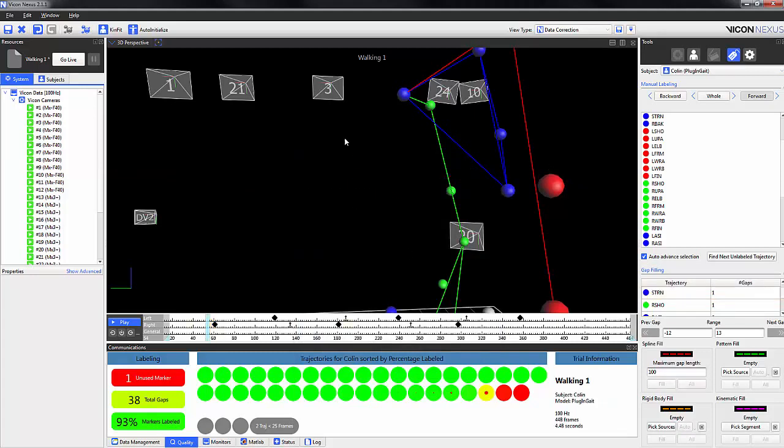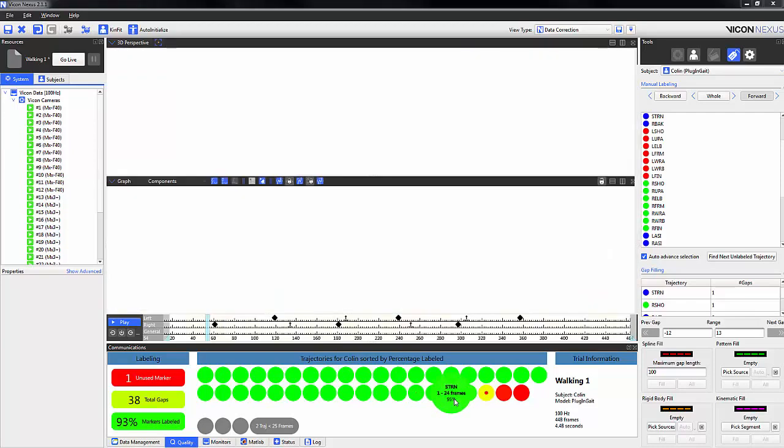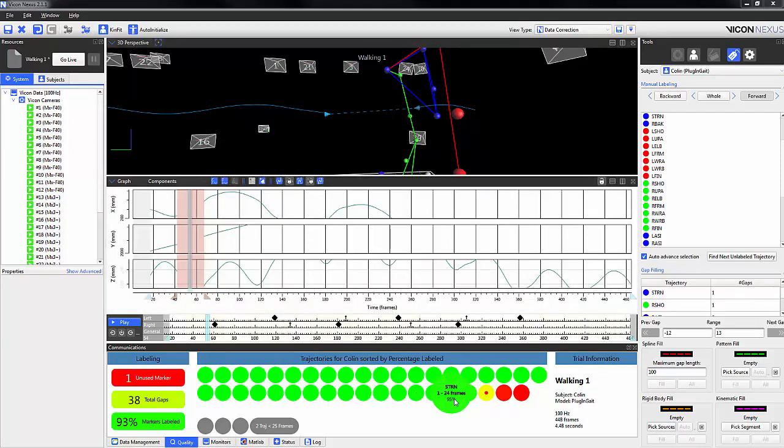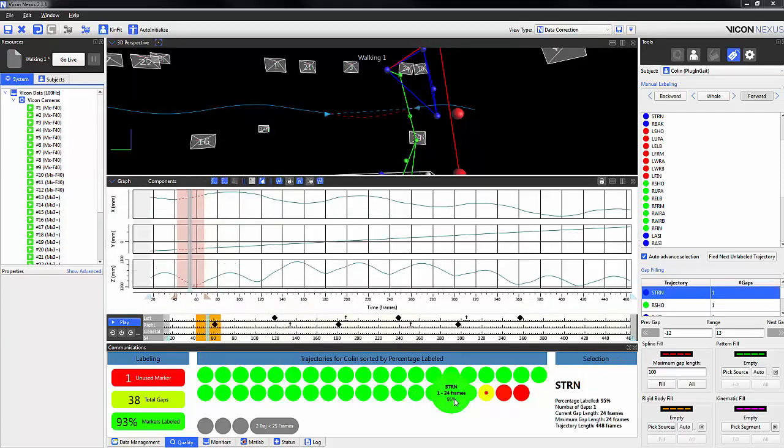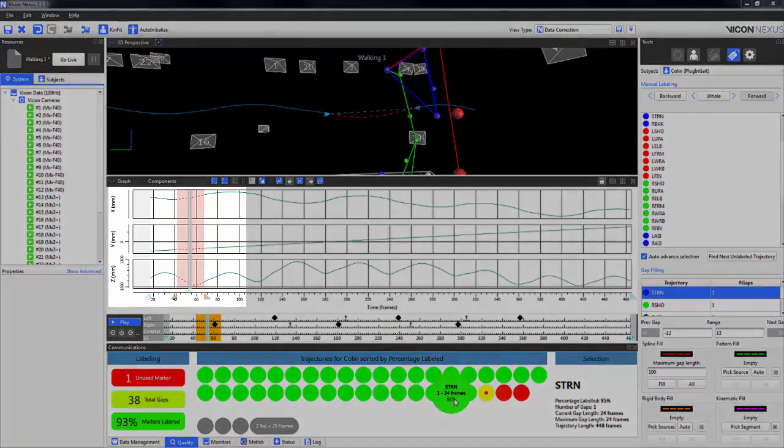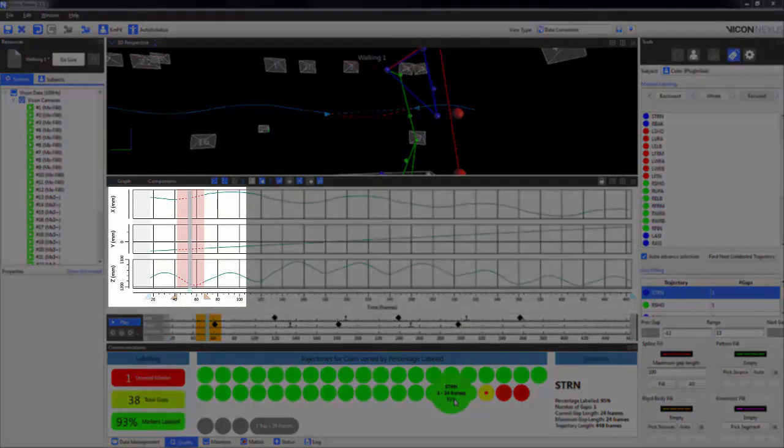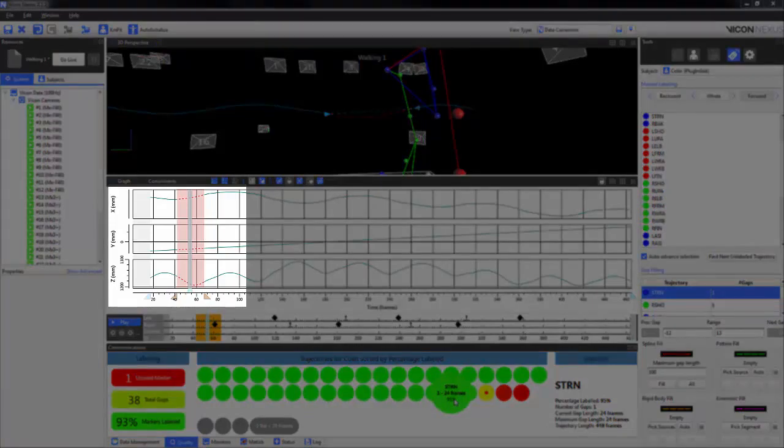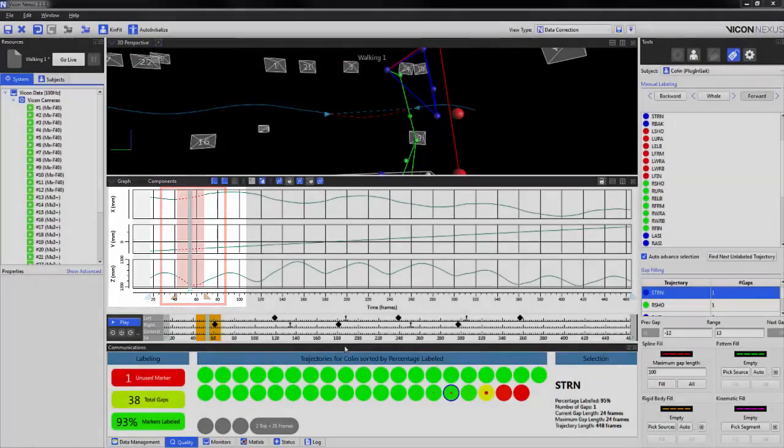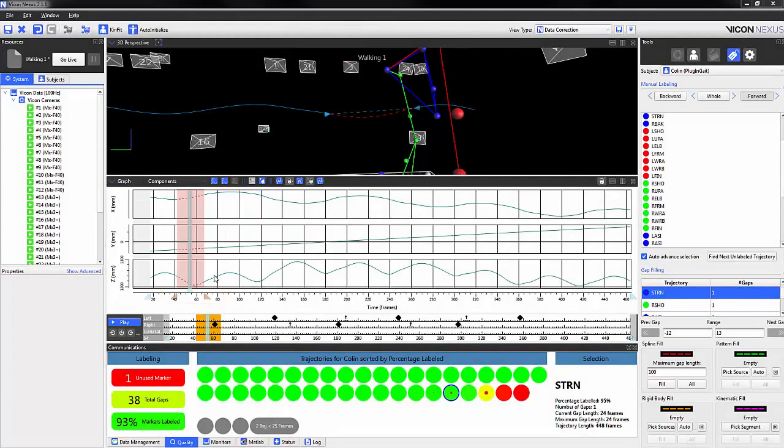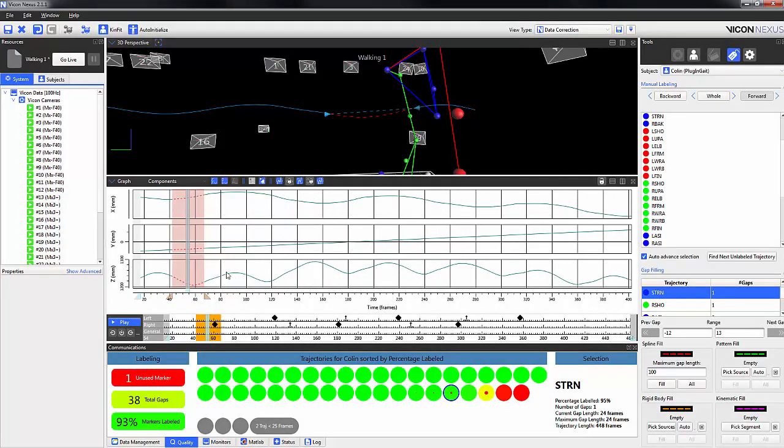Now if I highlight a marker, we can see that a graph of the X, Y, and Z components of the trajectory opens up, with the pink section indicating the region where the trajectory is missing, and the red dotted line indicates the spline fill.